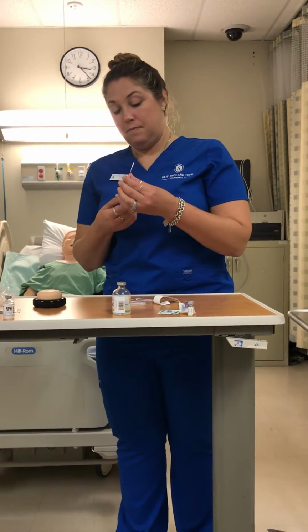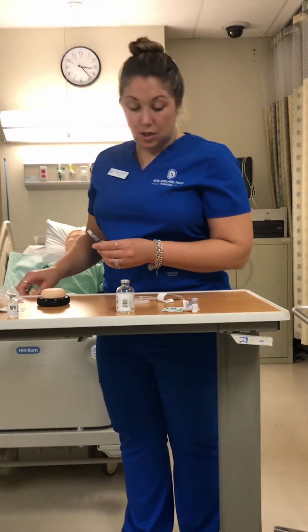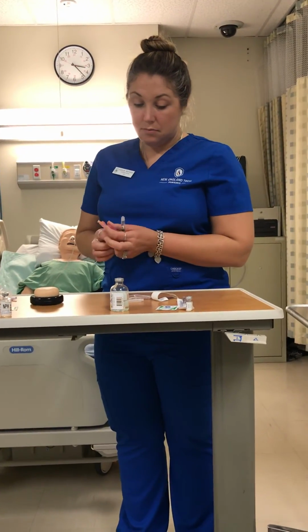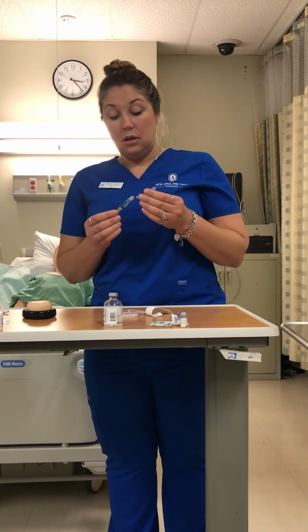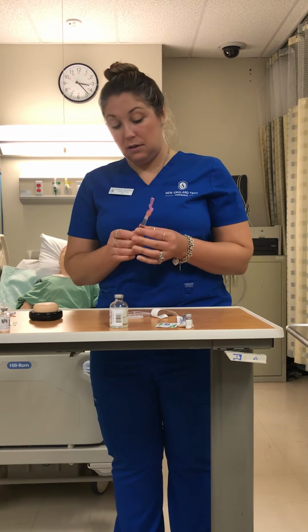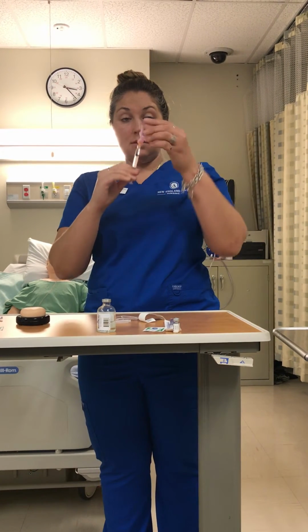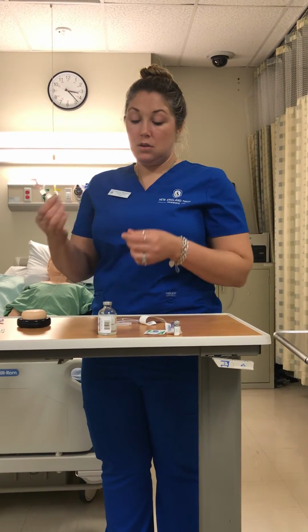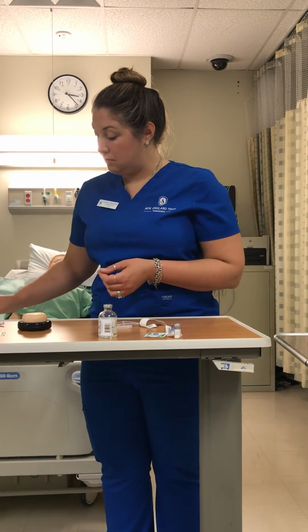And then you could untwist that. And then you would then, depending on, like I said, the size of the patient, add your specific needle. Okay, you want to make sure that there's no air in the syringe. Perfect. And then you would go 90-degree angle, administer the medication.